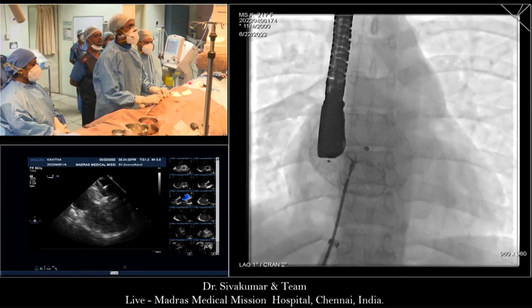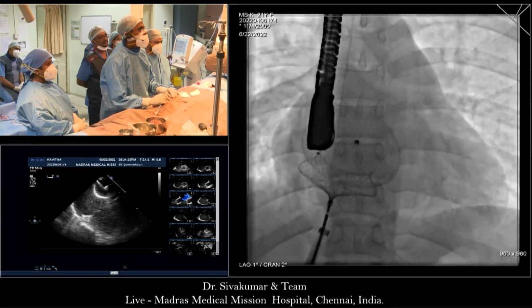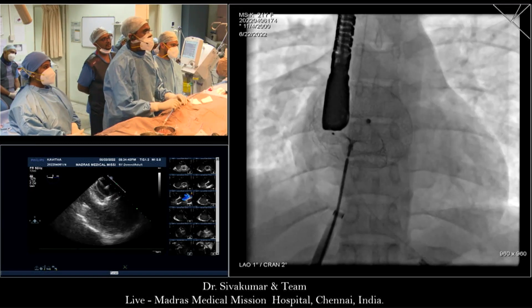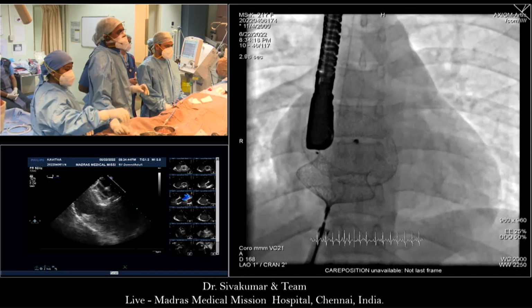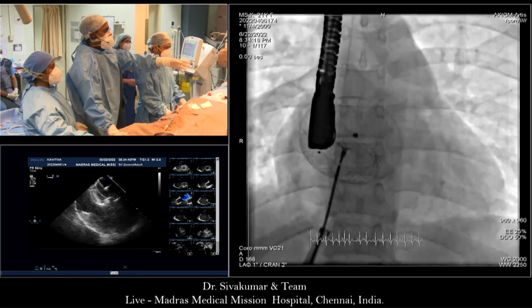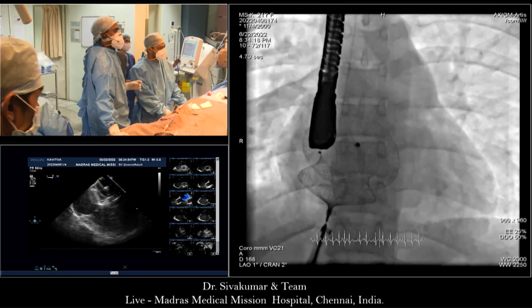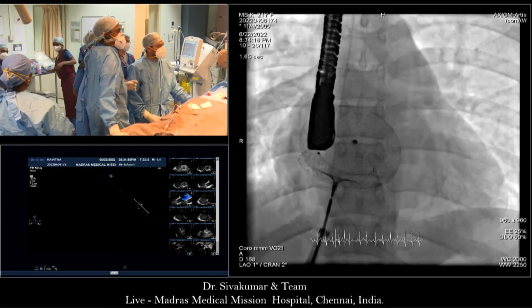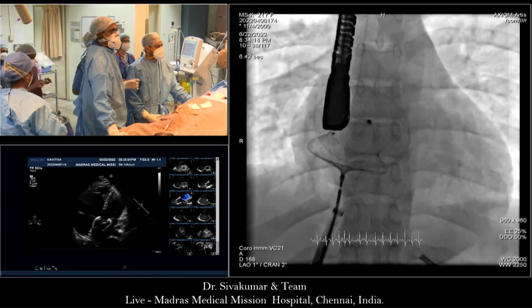Siva, on transthoracic, again you put color there, close to the left atrial disc, because I saw some regurgitation close to the left atrial disc on transthoracic. No, actually there is no flow, Bharat. But do a flow towards the disc, on the LA disc. You are showing transthoracic, Srija? Okay. I did a wiggle in between.